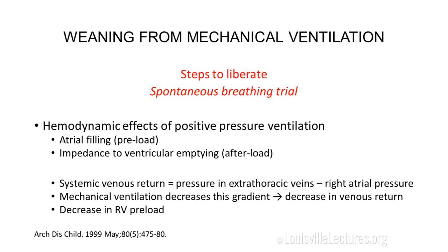And what about the hemodynamic effects of pressure support and PEEP? We're going to look at the preload, so atrial filling, and the afterload, so impedance to ventricular emptying. Systemic venous return, so the preload, is equal to the pressure in the extrathoracic veins minus the right atrial pressure. Mechanical ventilation decreases this gradient. The positive pleural pressure is transmitted to the right atrium, so there's a decrease in the venous return. Therefore, mechanical ventilation decreases right ventricle preload.